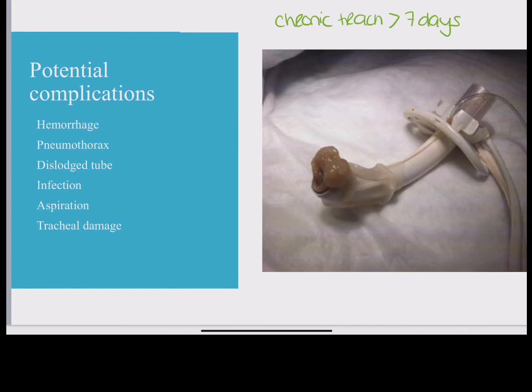Basically, with a chronic trach you're going to provide oxygen, monitor your patient, alert your doctor and respiratory therapist, and anticipate tube replacement. Now, if you have a new trach that is less than 7 days old, a nice fresh trach will become unstable if it dislodges.